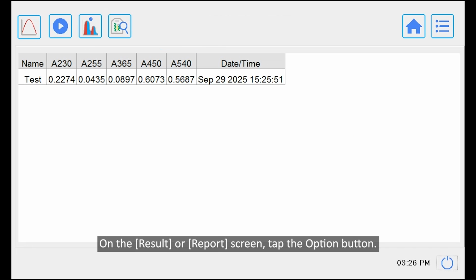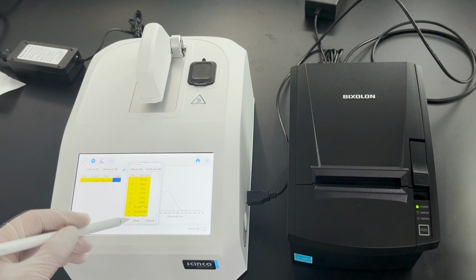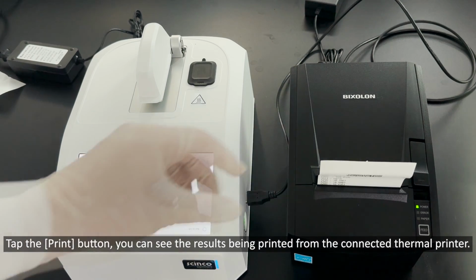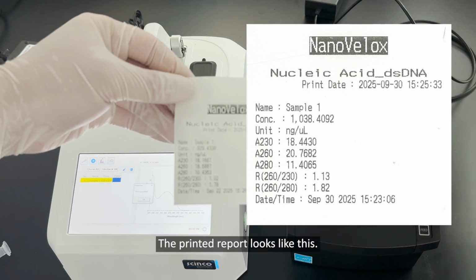On the result or report screen, tap the option button. Select Report Print, then tap OK. Here, the NanoVelox is connected to an optional thermal printer. Tap the print button. You can see the results being printed from the connected thermal printer. The printed report looks like this.